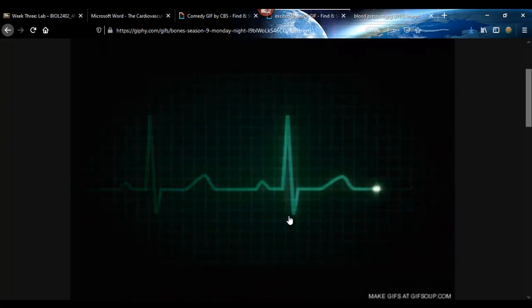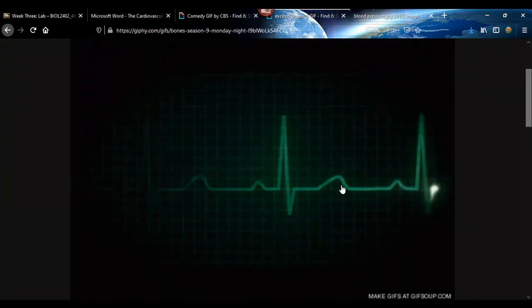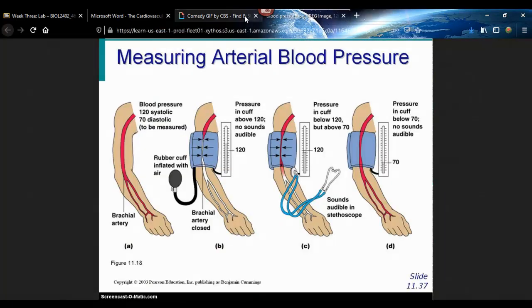And then I'll leave it down here. S there. And then you see the T wave is kind of flat, it's taller, but it's spread out a little bit more right there. That's a T wave. So that's how to read an EKG.